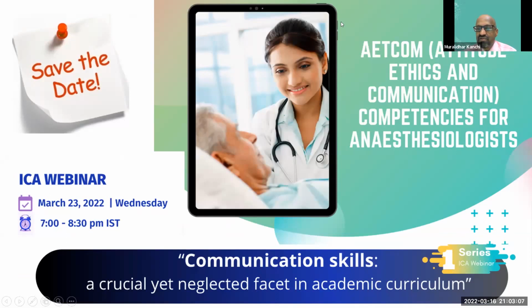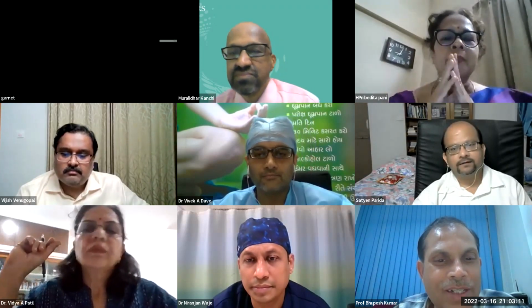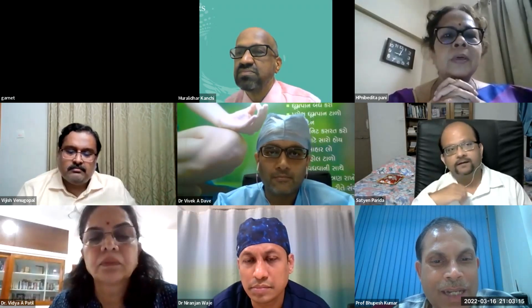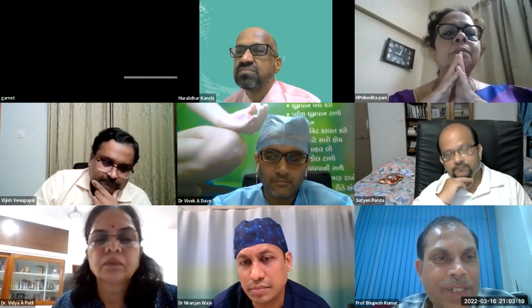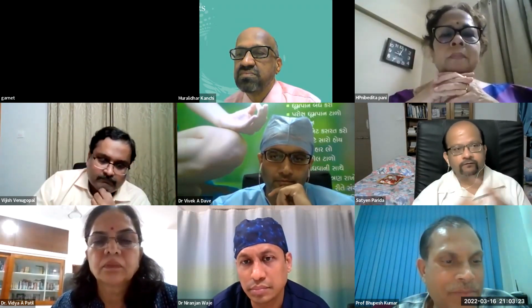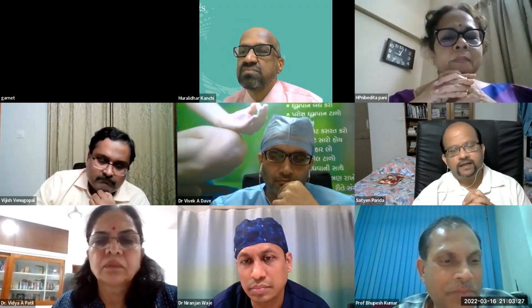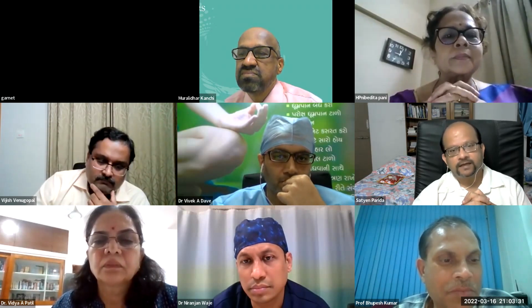That was related to AV sequential pacing. That has already told us: if we measure stroke volume and multiply it by the heart rate, it will be the cardiac output. Ultimately, it is the cardiac output that matters, because the cardiac output and the MAP might actually go in very opposite directions. So we eventually have to look at the cardiac output, but it's not always that we get the benefit of directly looking at the cardiac output all the time.